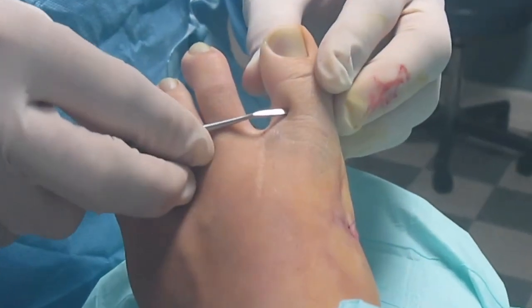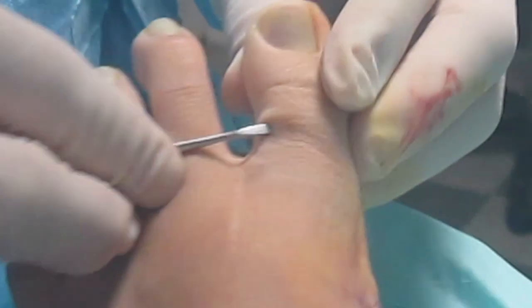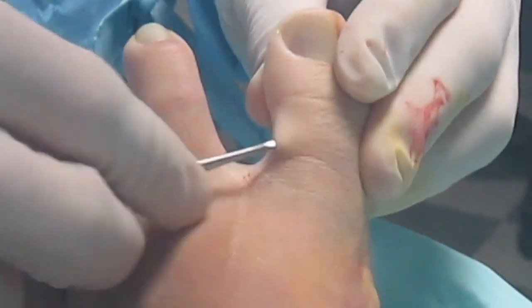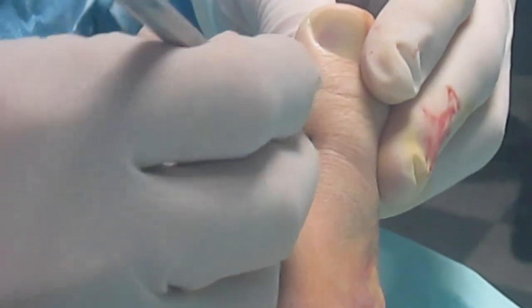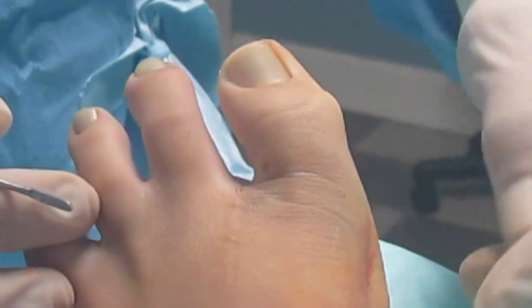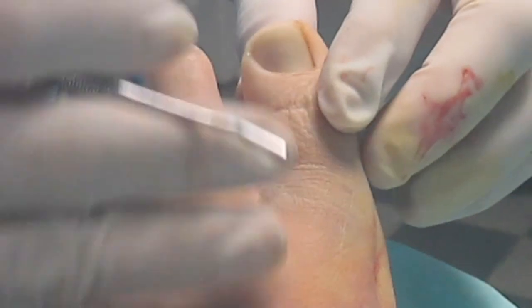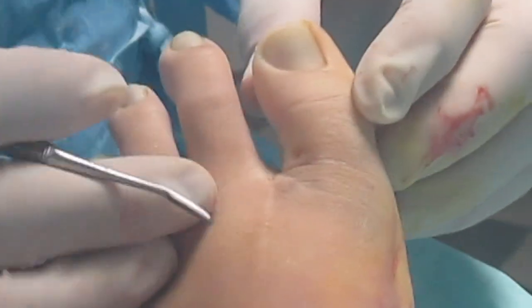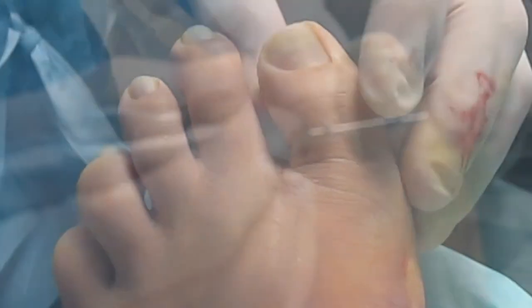Okay, so we're going to go through our incision here and just underscore this. I'm right against the bone here. That takes my soft tissue out of the way. And then we'll come underneath and we're going to underscore here like this. So we've got the soft tissue and the vessels all out of the way. Now at this point, we were up on the tourniquet for this. We may get some venous flushing, but we'll take the tourniquet down because we want the tourniquet down when we start using the burr. So now we're going to take the tourniquet down.